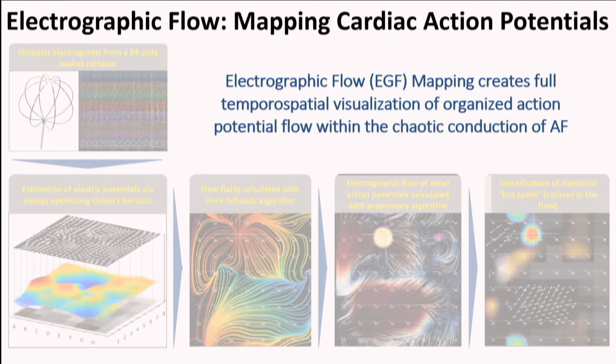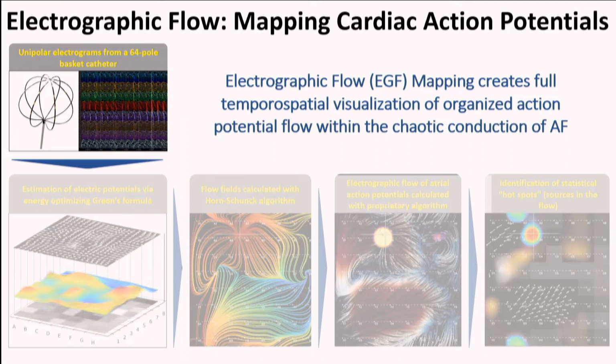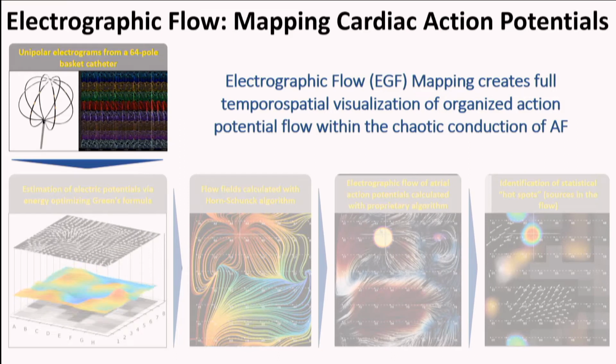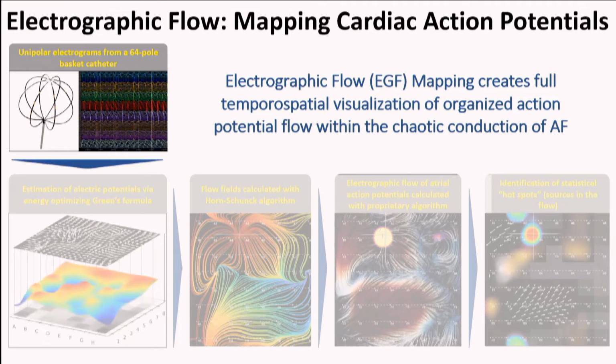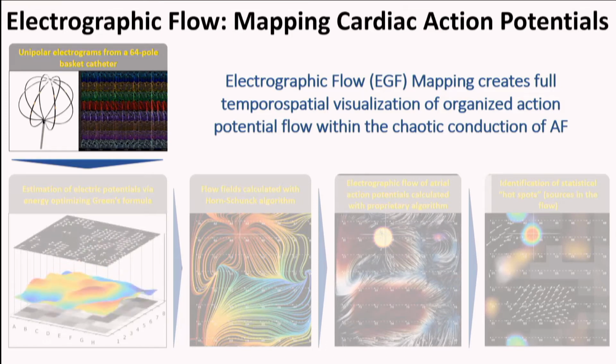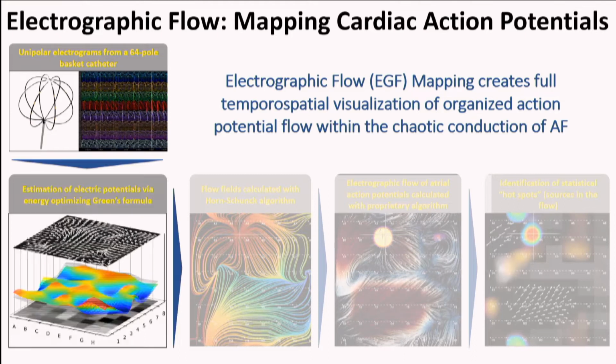So how do we map the cardiac action potentials? In broad strokes, we take a basket catheter. It was the Topera basket, which is all we have available, though the company is actually making their own basket catheter, which seems to be much better in terms of not splaying the splines. But again, today we're just using the Topera basket.